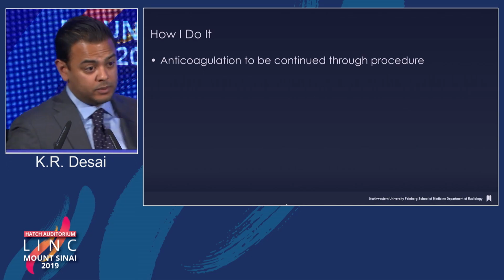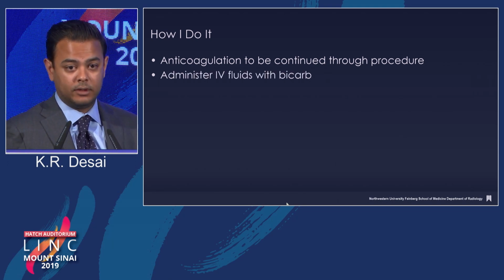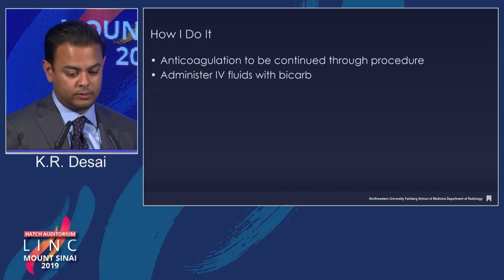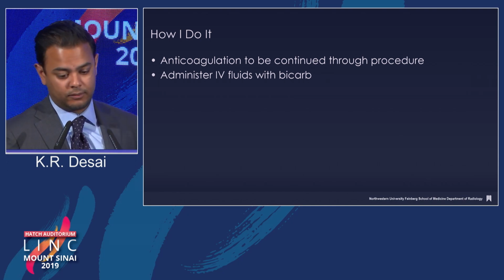So I keep these patients on anticoagulation through the procedure. I think it helps to have that baseline level of anticoagulation. I supplement it with intraprocedural anticoagulation. I like to administer intravenous fluids with bicarb, and it's primarily dictated by my device of choice. And again, you've seen that there's many different ways to do this.